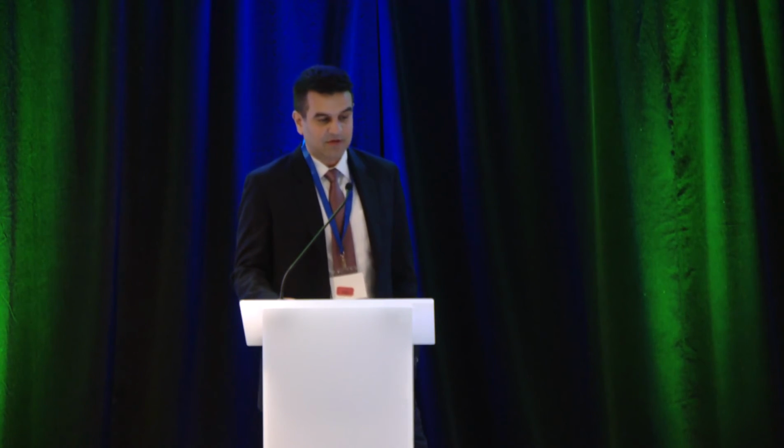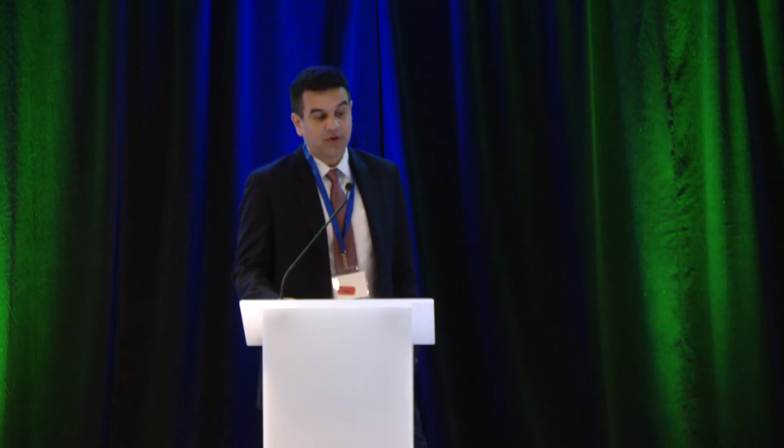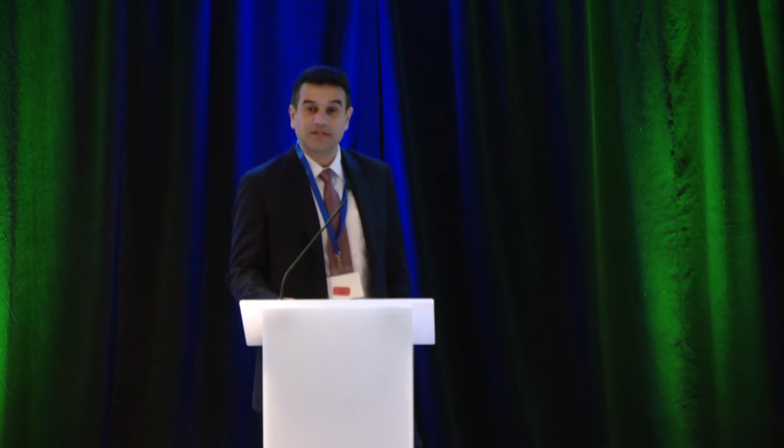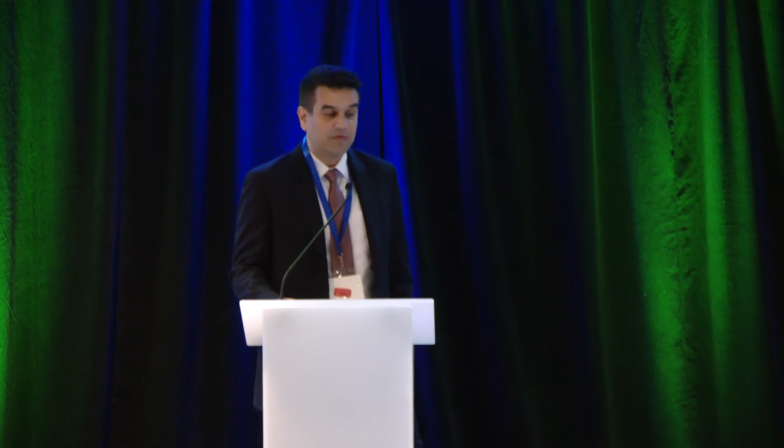You may have an inconclusive manometric diagnosis if, let's say, you do have 20% or more premature contractions, however, the DCI is weak, or you have at least 20% where the distal latency is actually normal, but your velocity and that slope of peristalsis is almost vertical, typically with a velocity over 8 centimeters per second.